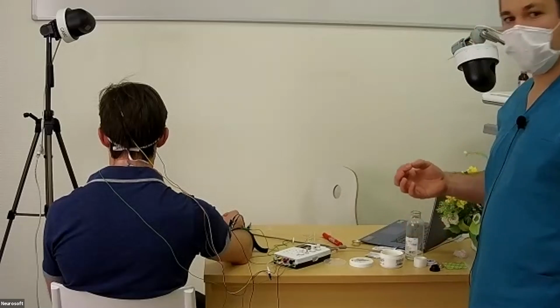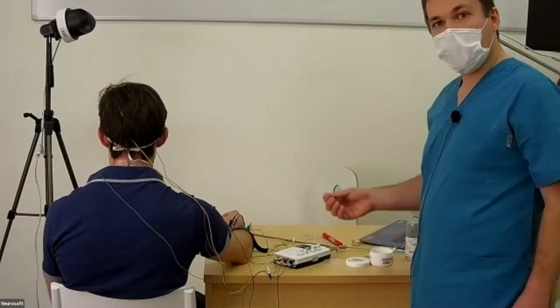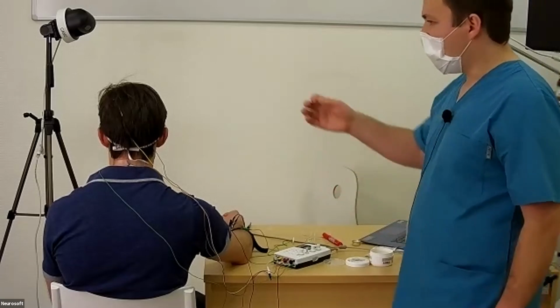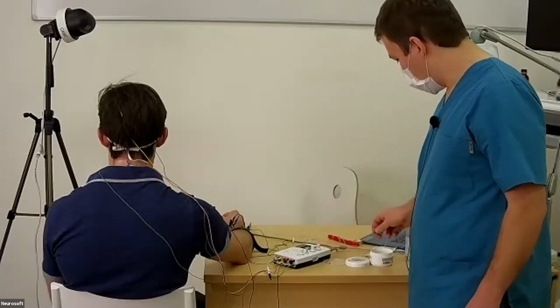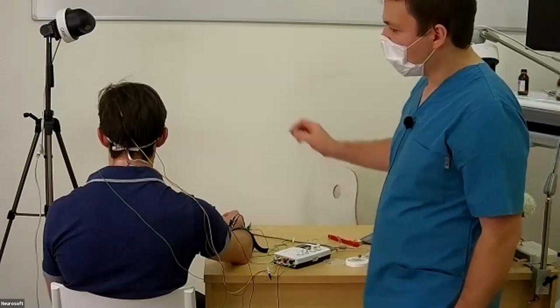So we need to prepare the skin very carefully. We should use alcohol and also some abrasive paste before setting the electrodes. After that, we add cup electrodes with adhesive paste.